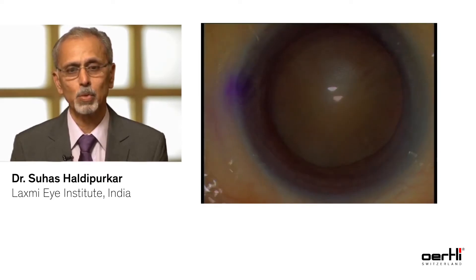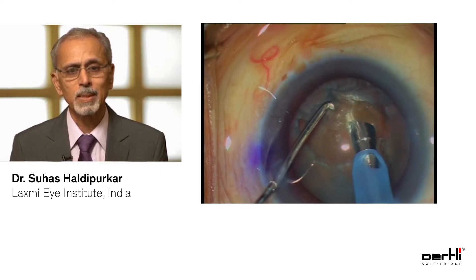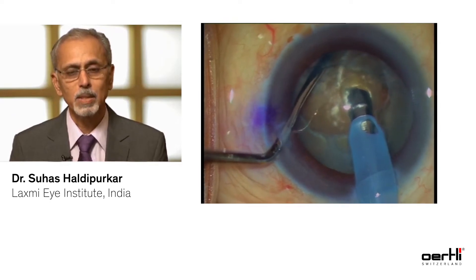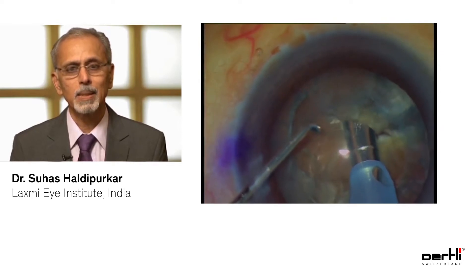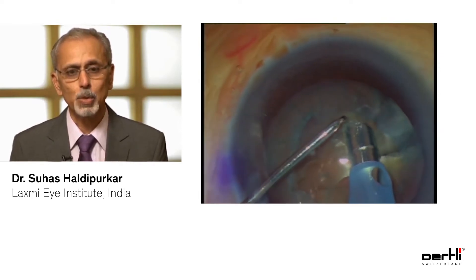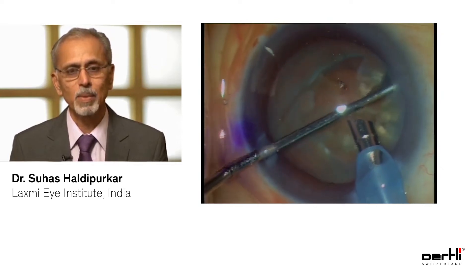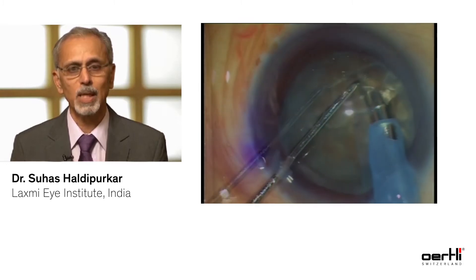This is one of those hard cataracts. After viscoelastic is injected, a rhexis is performed. This is the Easy Tip 2.8 to tackle or disassemble these nuclei — you should get an excellent purchase on the nucleus. Keep your phaco tip in the center and get a good hold on the nucleus, then use your sharp tip chopper.